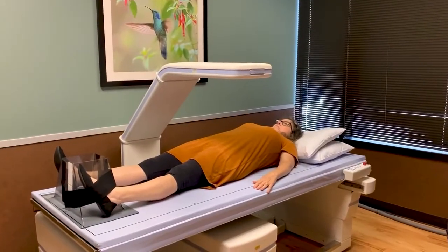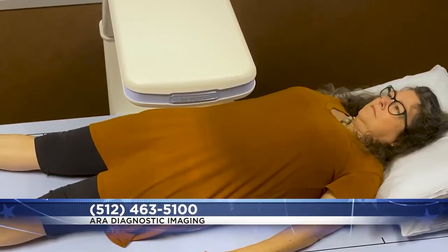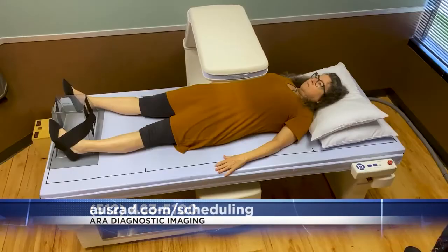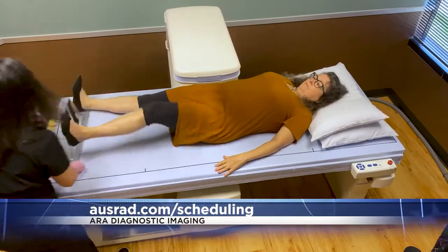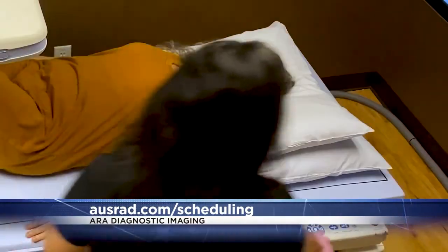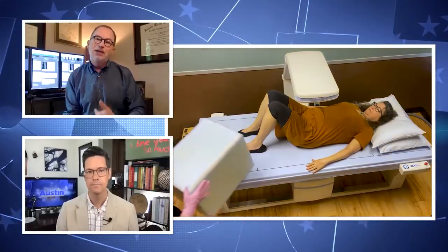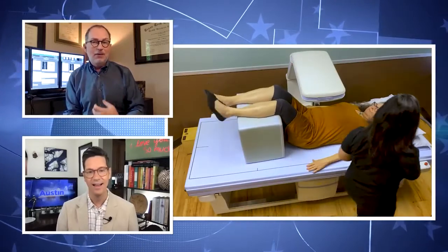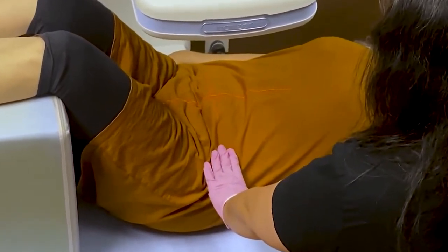It's very low-level radiation. In fact, the equivalency of this dose of radiation is to being outside for two days. Basically, the x-ray beam goes through the bone, and the amount of impedance — the amount of x-ray beam that doesn't penetrate the bone — tells you how much density is actually within the bone. So we can tell the density of the bone and how much mineral content is within it, and then we can give a diagnosis of osteopenia or osteoporosis.